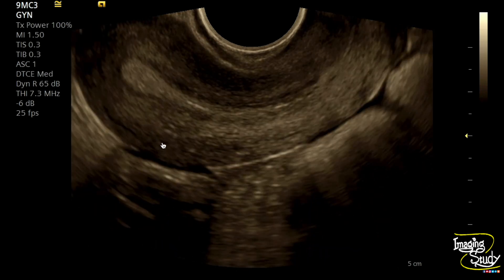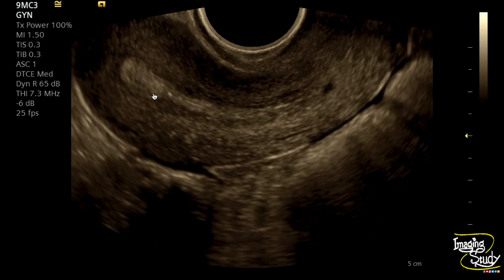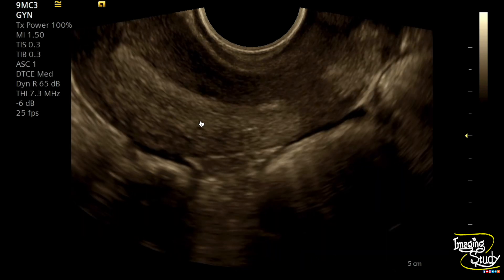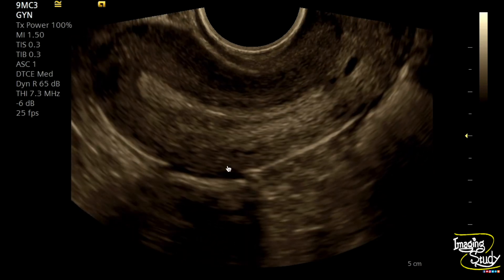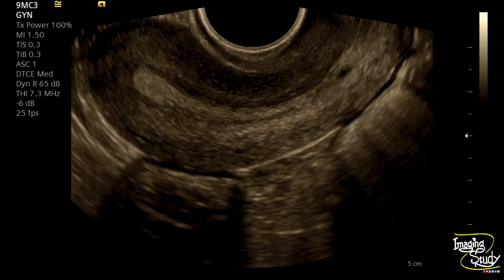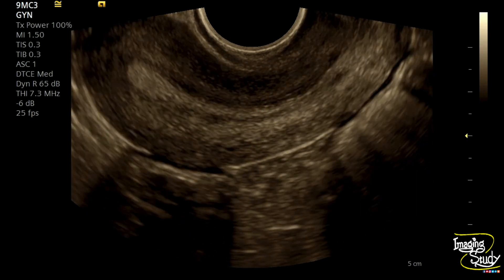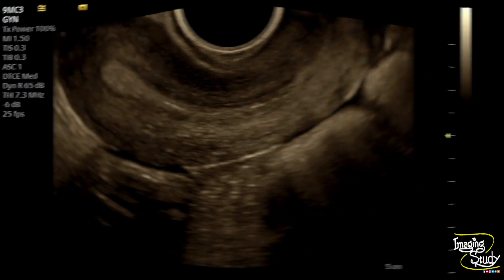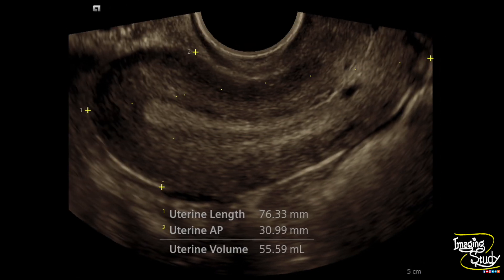The uterus is normal in size and the central endometrial echo looks quite normal. Here's the measurement and the uterus is not bulky. You can see these tiny Nabothian cysts here.